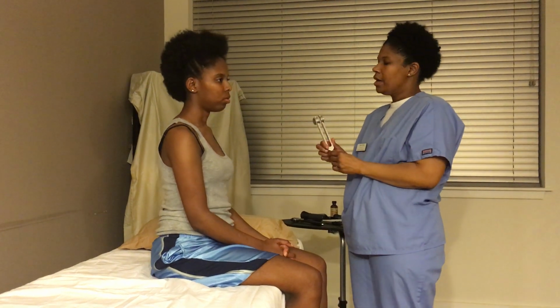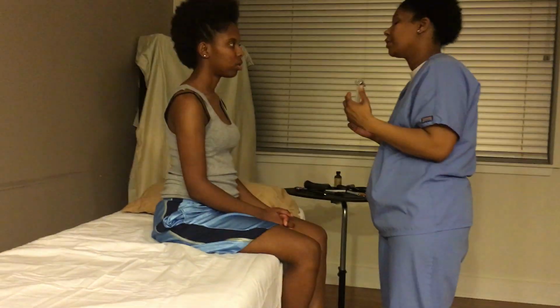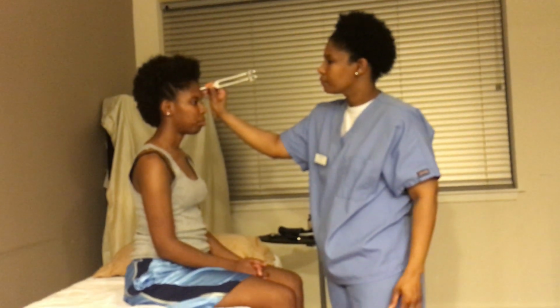I'm going to strike this instrument and place it in the middle of your forehead, and I want you to tell me where you hear it. Your right ear, your left ear, or both, okay? Both.